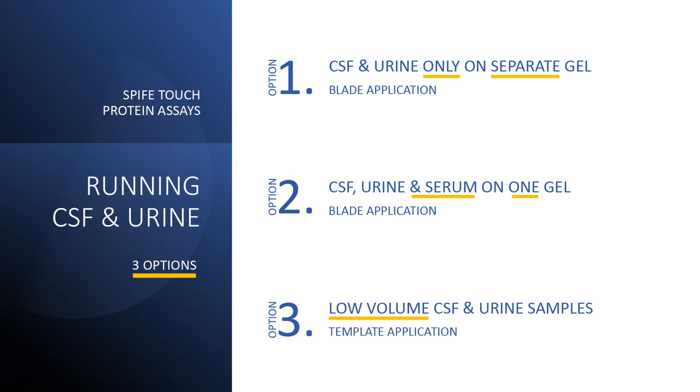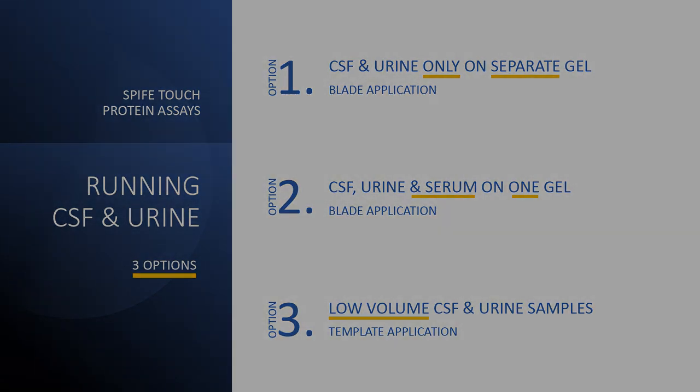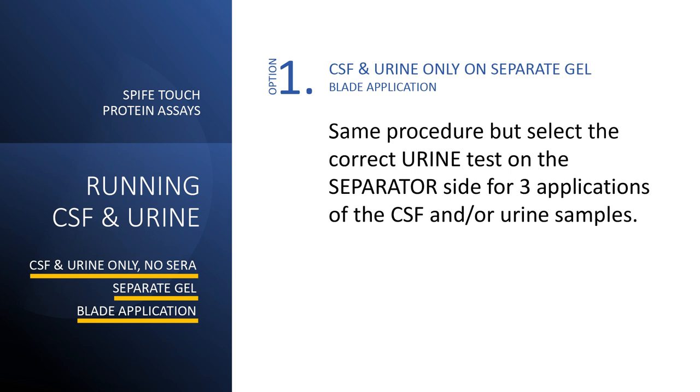CSF and/or urine specimens can be processed on a separate gel or on the same gel as serum samples, utilizing either applicator blades or template application. To run CSF and/or urine only on a gel using blade application, the procedure is exactly the same as described, but select the correct urine test on the separator side for 3 applications of the CSF and/or urine samples.